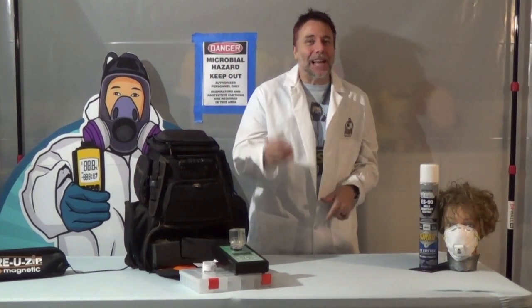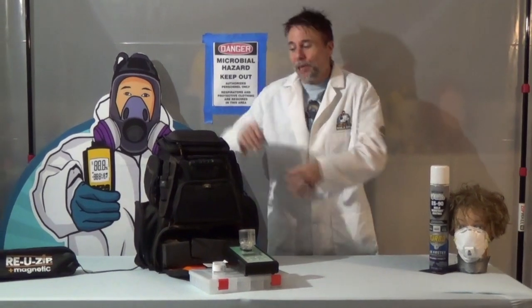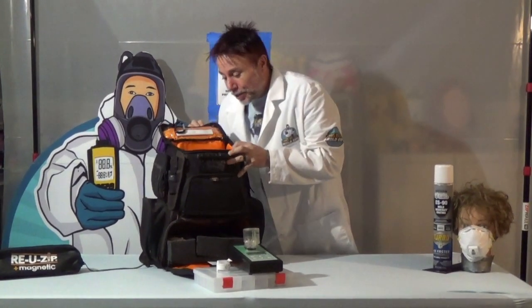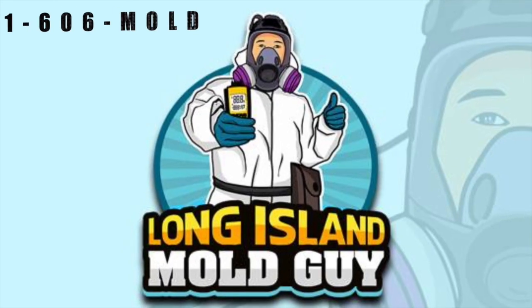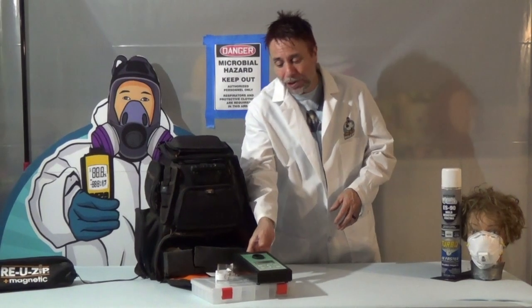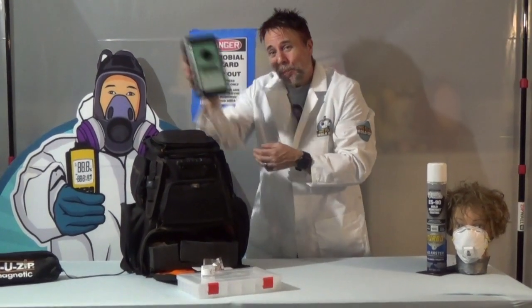What's up everybody? Long Island Mold Guy here, right guy for your fungi, with another installment of What's in My Bag. Thanks for checking in. Let's get to this and see what I got. Today what I have to show you is this little gem right here, the Bio Pump Plus.